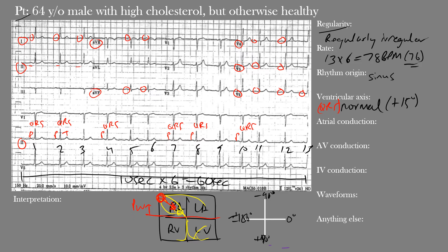To find the QRS axis, we typically use two leads. Lead I sits at 0 degrees and AVF at +90 degrees. Looking at lead I, the QRS complex is mostly positive, so we're heading toward the positive end — toward 0 degrees. Looking at AVF, the QRS complexes are also mostly positive, so we head toward the positive end of AVF as well. That puts us in the normal axis region. Normal axis lies from about -30 to +105 degrees; leftward axis deviation and rightward axis deviation lie outside this range.